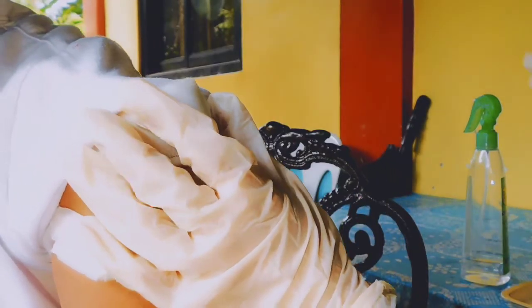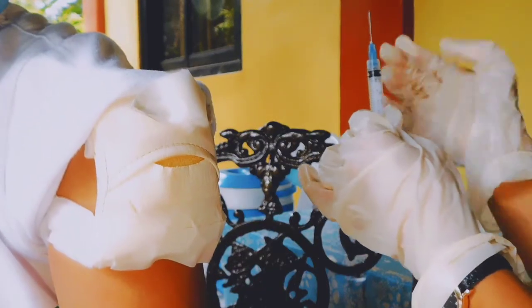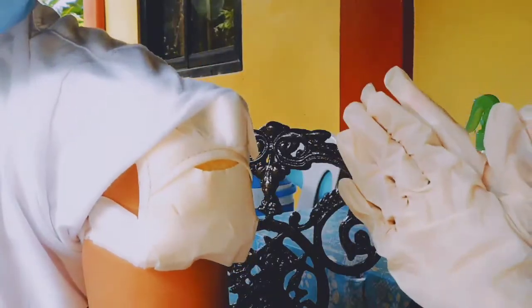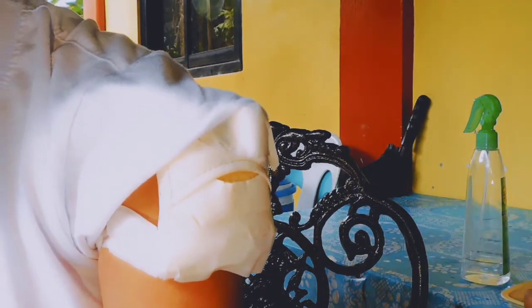In discarding, activate the needle safety device if it has one, and discard the uncapped needle and attached syringe into the proper receptacle. After doing that, thank you, ma'am. Does it hurt, ma'am? No, just a little. After that, remove the gloves and perform hand hygiene, washing or sanitizing.